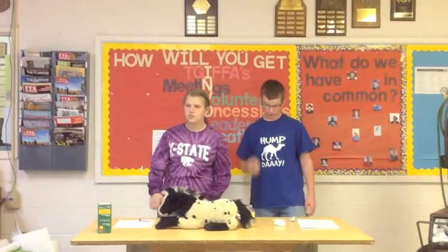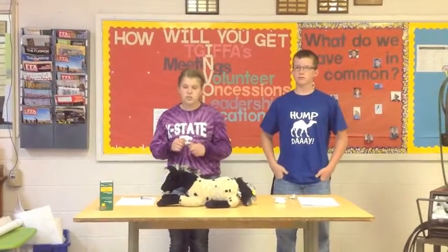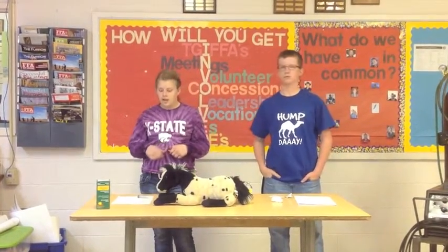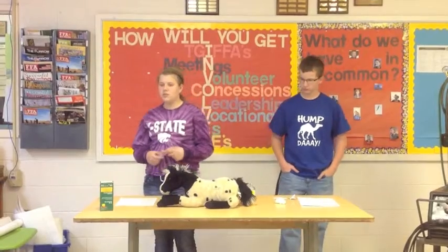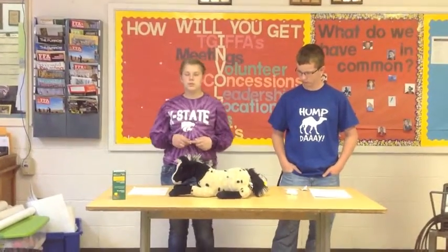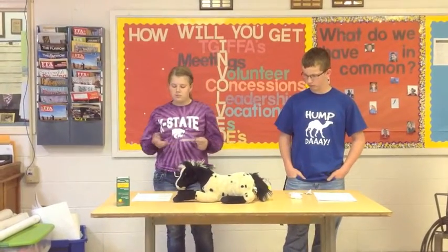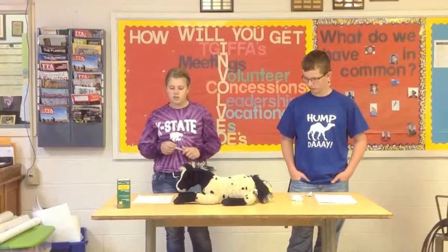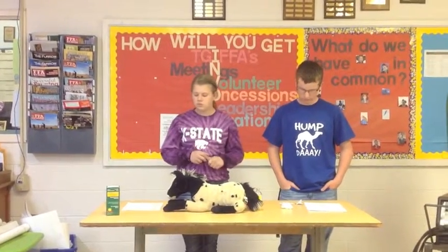First, you need to select your syringe and needle, and so we're using a 22 gauge 1-inch needle and a 12 milliliter syringe. So we've already prepared a label, but you need to include on your label the title of your drug, which we're using Banamine, the amount you're giving, which is 11 milliliters today, the date, the name of your animal, and your initials.